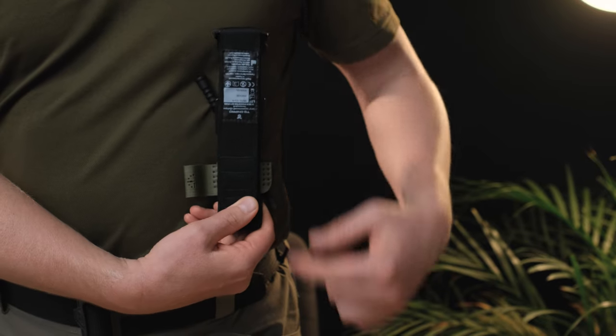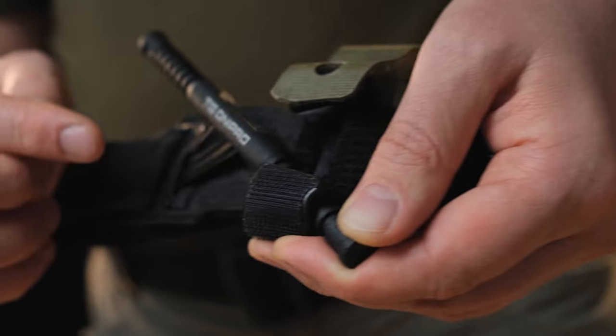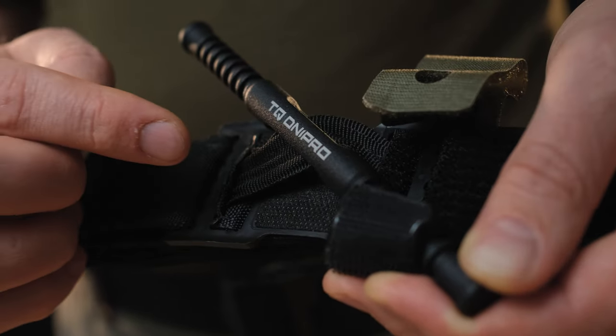In an individual first aid kit, if you attach it anywhere in the open, always place the collar against your body. This will ensure relative safety for the internal sling of the tourniquet.